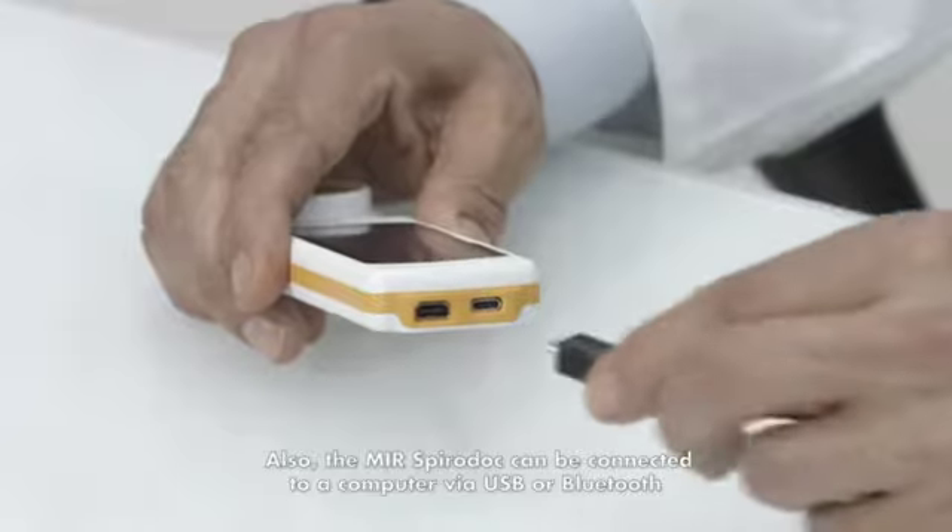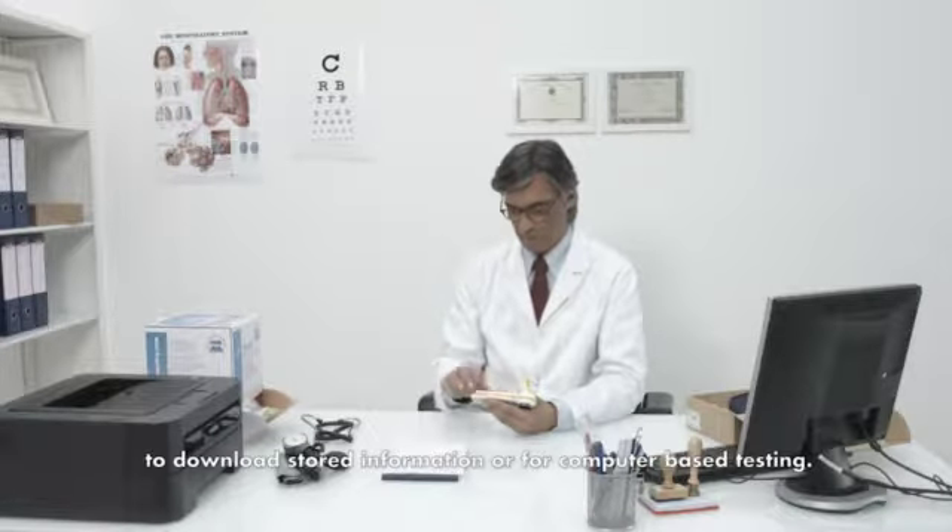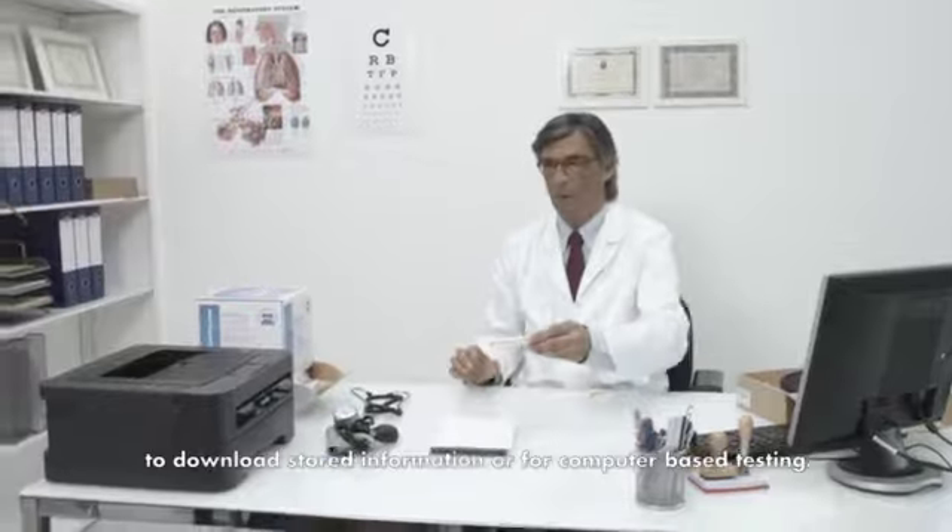Also, the MIR SpiroDoc can be connected to a computer via USB or Bluetooth to download stored information or for computer-based testing.